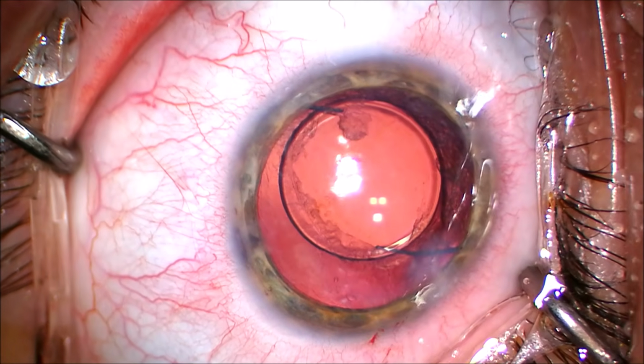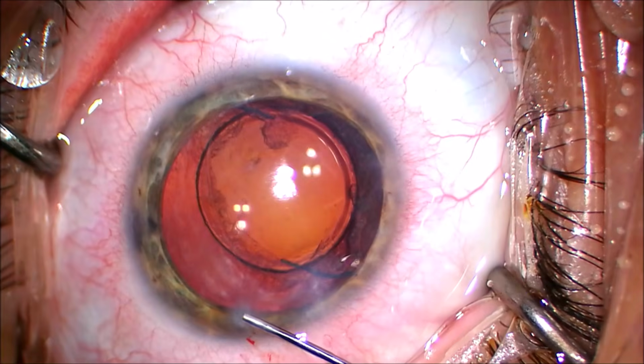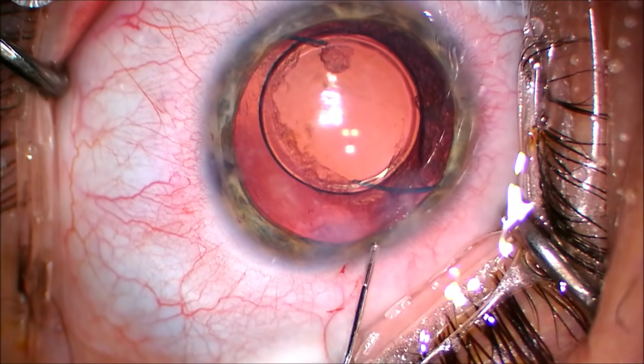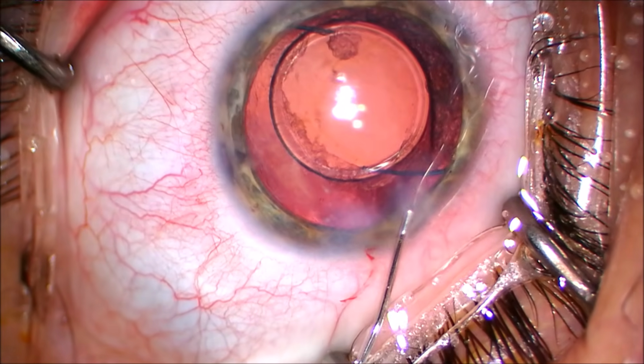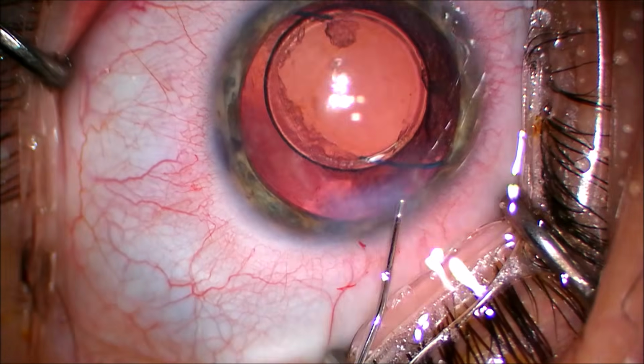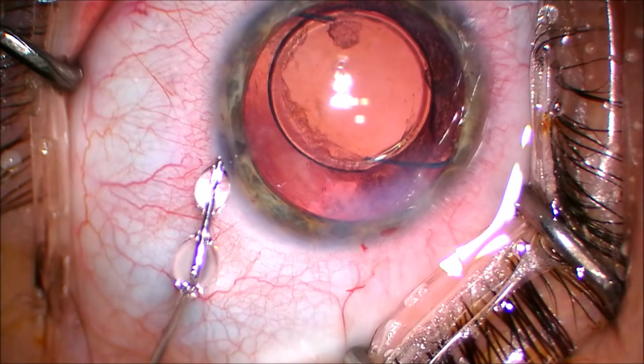And so this is a rather interesting case, a unique case, and that's why every case is different. This patient presented with sudden loss of vision, had a congenital cataract. There's this hook of the haptic. The haptic was hooking the edge of the pupil.